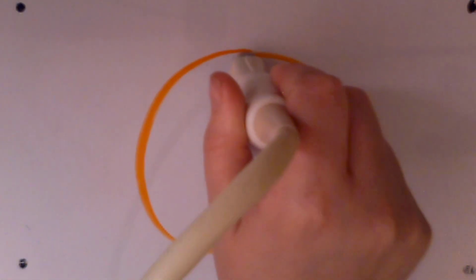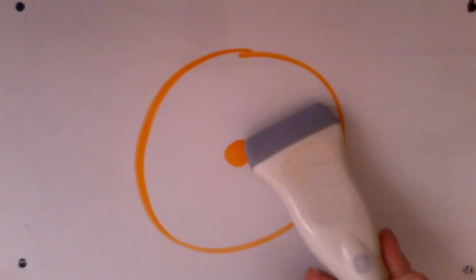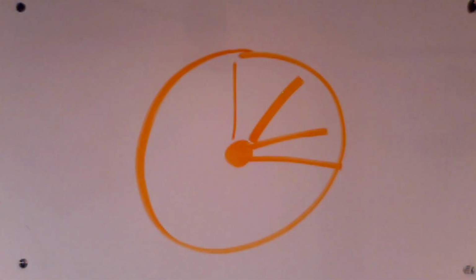So I just want to show you here on a breast again. If we are at the noon, this is off to the side here. This is radial. I am following the noon. This is radial to 1 o'clock. This is radial to 2 o'clock. This is radial to 3 o'clock if we're on the left breast. Actually, if we're on either breast, it doesn't matter. These are our radial positionings. Okay, so I'm following these lines out. These are all radial. Anti-radial then is going to be 90 degrees to it.